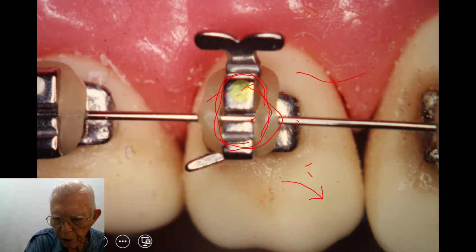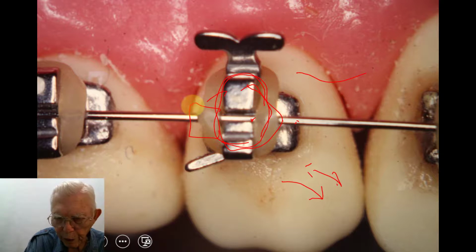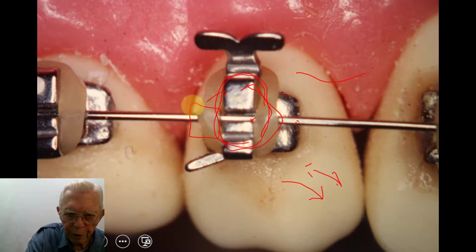Or if you want this to come out, bring it out this way, you can put a wedge under it, a little plastic wedge, and rotate it that way. Now here we drop this slot. We have some soft metal material.